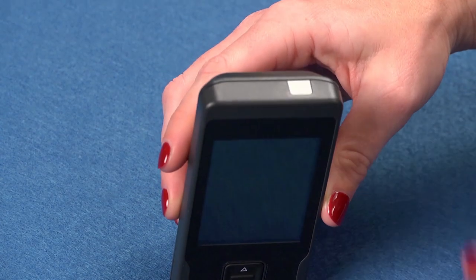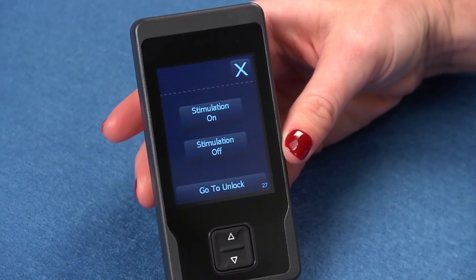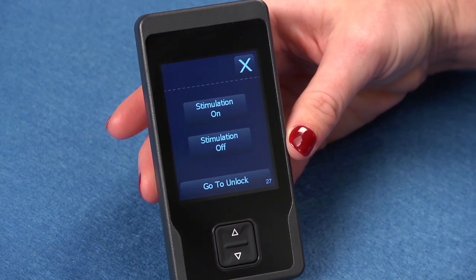When the programmer is locked, you can still press the stimulation on-off key to bypass the unlock screen to turn stimulation on or off.